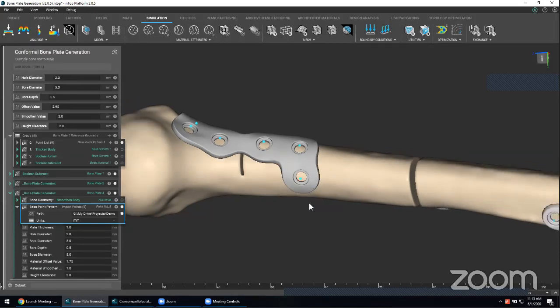So using the nTop platform, not only are you empowering the design engineers by providing these robust tools and essentially giving them their time back, but you're also closing the gap between surgeon and solution to ensure better patient outcomes overall.